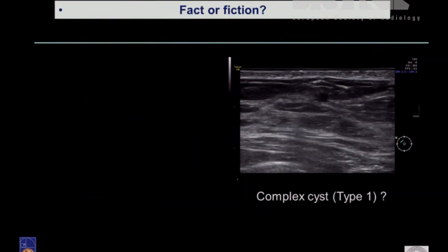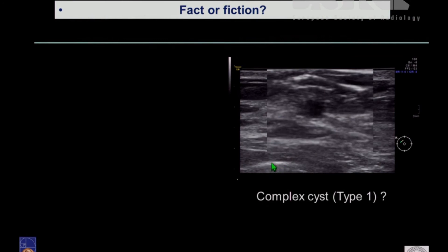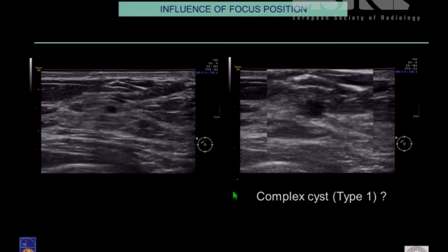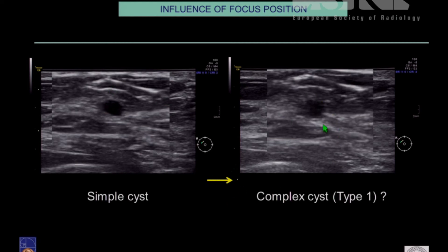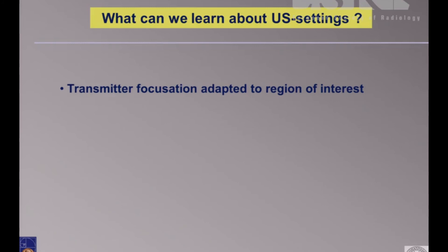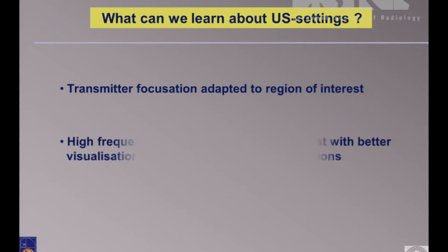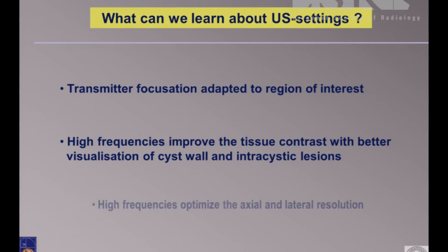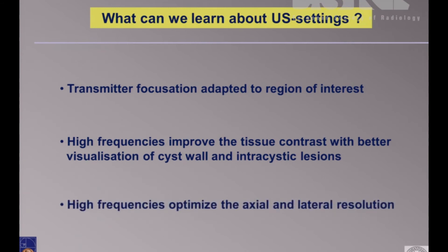Fact or fiction: Is this a complex cyst? Is this a solid lesion? I would say a good question. This is the same structure — completely clear. This is a microcyst, and this is only a focus close to the chest wall. This lesion is completely out of focus. That means you have to keep an eye on whether the settings are in proper position so you really see the structures correctly. The transmitter focalization has to be adapted to the region of interest. High frequencies improve tissue contrast with better visualization of cyst wall and intracystic lesions, and optimize axial and lateral resolution.